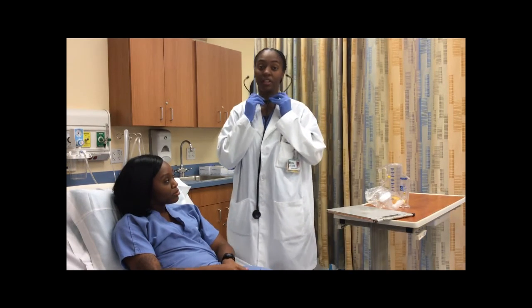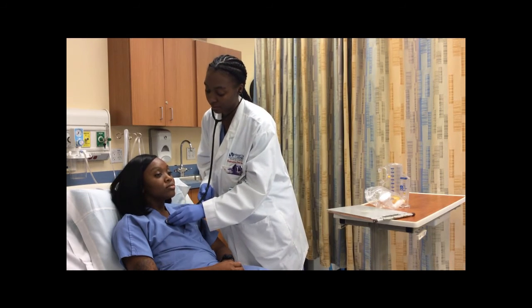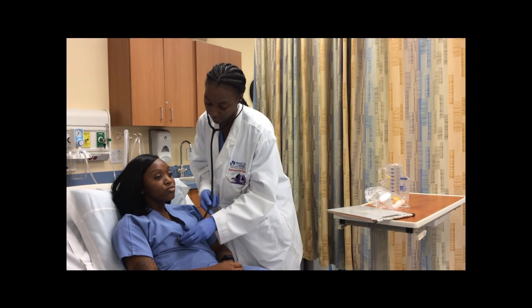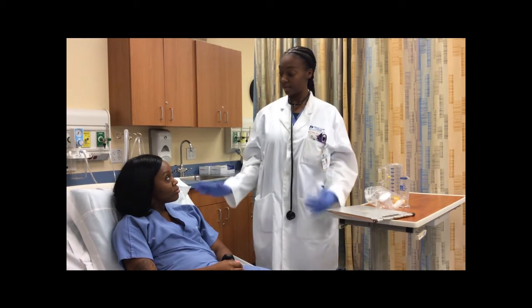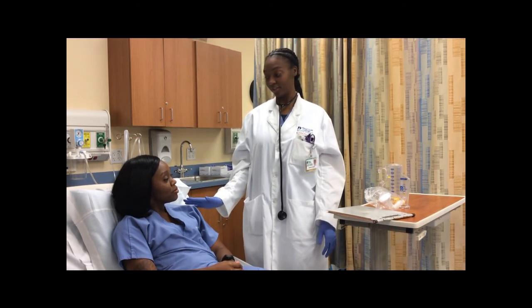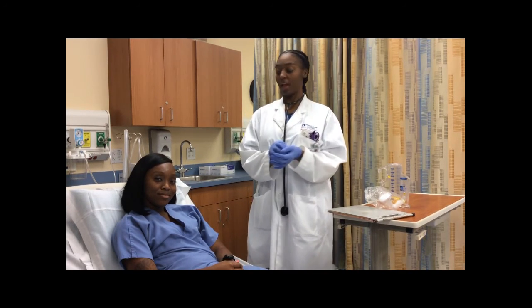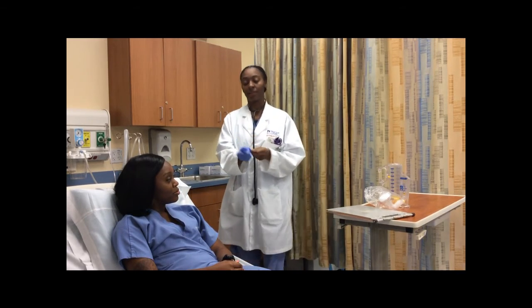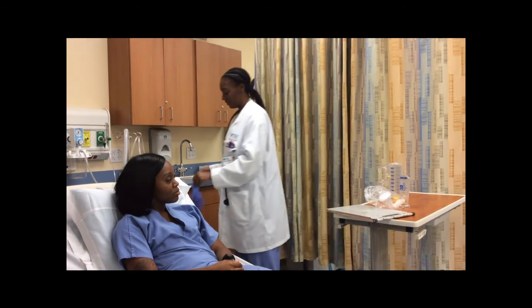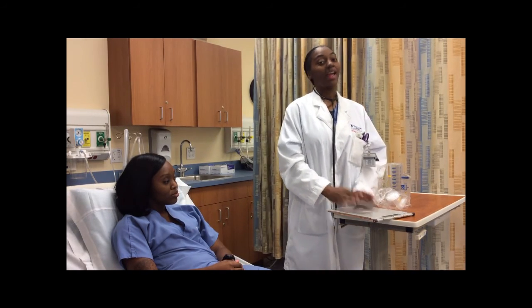I'm going to reassess my patient's vital signs and breath sounds. Are you okay? Do you need anything from the nurse? No, thank you. I checked if my patient is okay, and I'm going to remove my PPE. Wash my hands again for 15 seconds. I'm going to chart down my findings, and that is it.